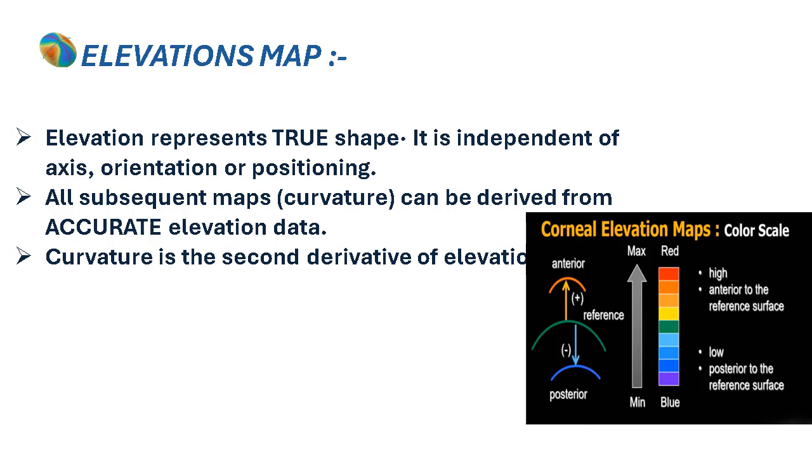As we said, the projection-based topography or elevation-based corneal topography primarily measures the elevations of the cornea, and this also gives good information about the curvature of the cornea. However, the Placido-based or reflection-based topography primarily measures the curvature, and by particular calculations and assumptions, it can give information about the elevations. However, it is not as accurate as in the projection-based corneal topographies.